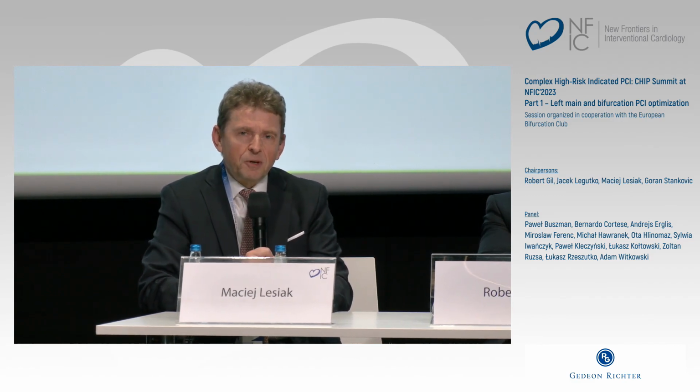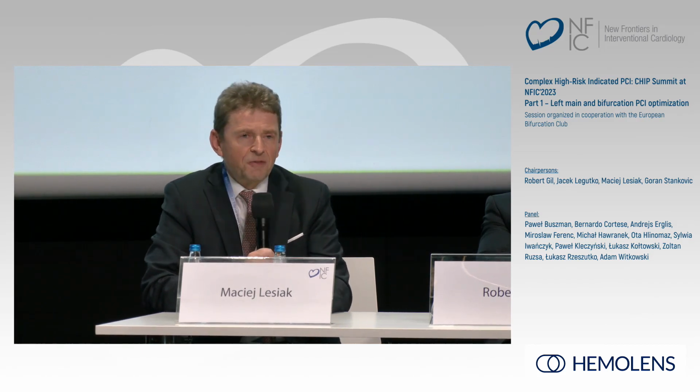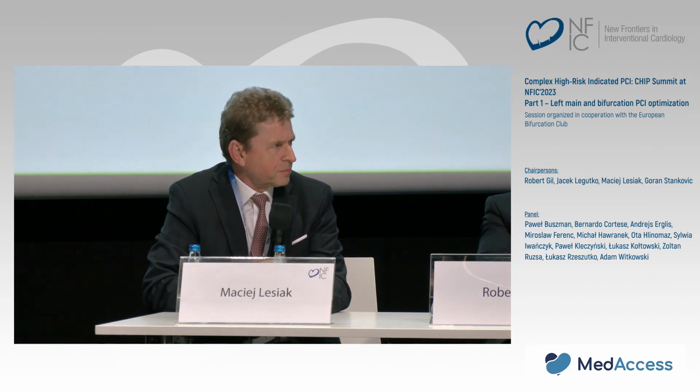The amount of information that OCT gives you is huge. If you don't see any edge dissection, any malapposition, or underexpansion, you will never see it on angiography. So this is why I love OCT for these indications. For left main, I still stay with IVUS.